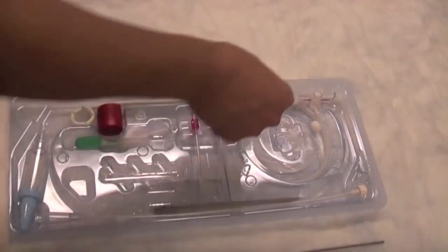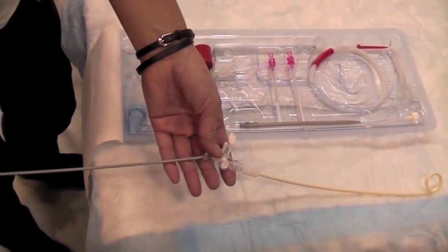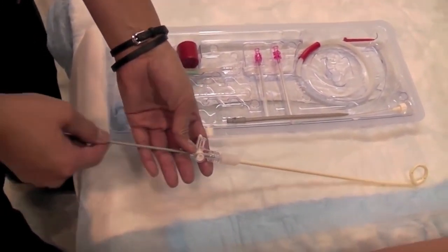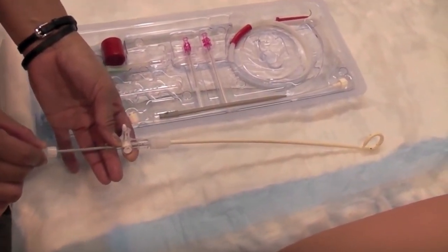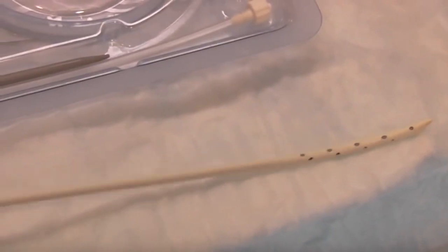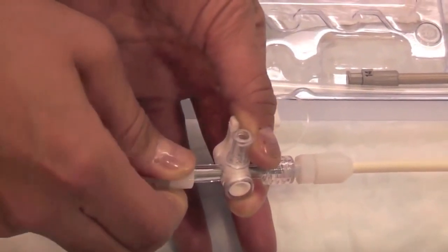During preparation for the procedure, insert the obturator into the stopcock, which is already attached to the pigtail catheter. This will unwind the curl of the pigtail. Attach the obturator to the stopcock by luer lock.